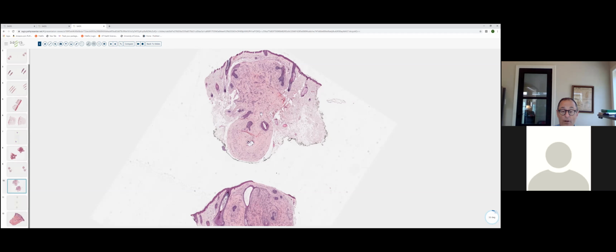It's got a prominent mesenchymal component, a big orb of fibromucinous stroma, hence the term fibro, and it's got these primitive follicular structures in it, hence the term follicular. So fibrofolliculoma, and remember the association with Birt-Hogg-Dubé syndrome, where patients can also get trichodiscomas, which are probably the same tumors as fibrofolliculoma, and acrochordons and perifollicular fibromas as well.